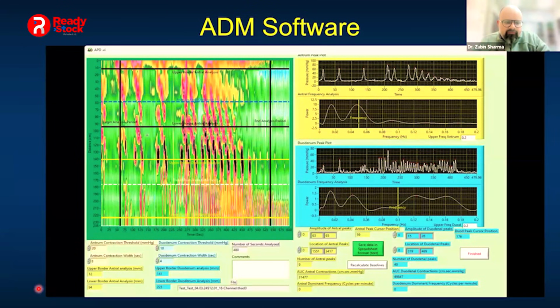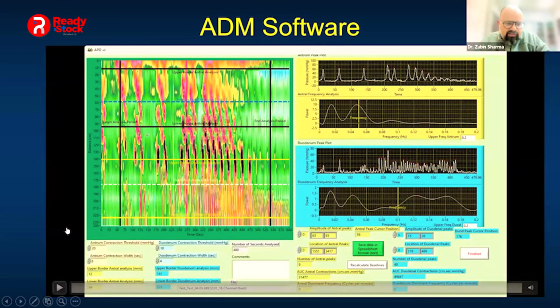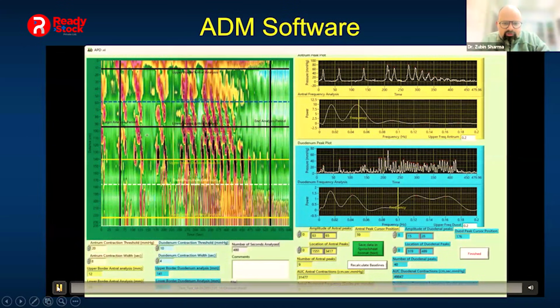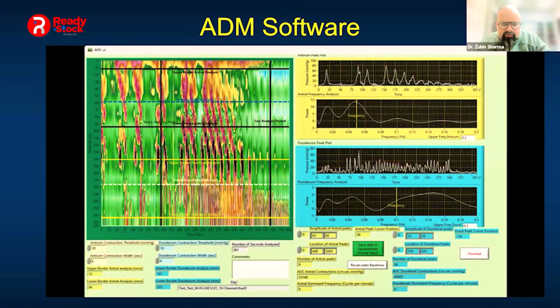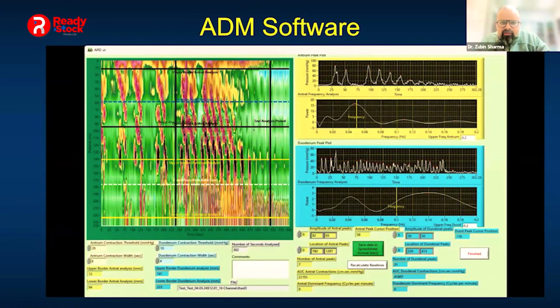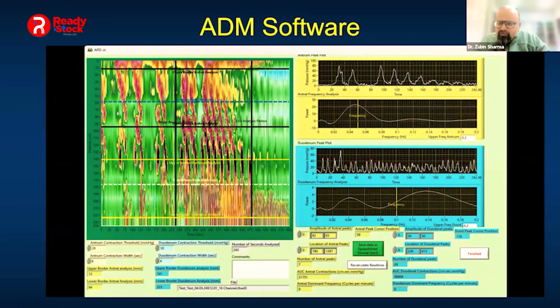And we also have the added software. Dr. Hubbard was kind enough to make it for us. You can use this. I think it will be given to you along with the catheters. Here it's not like the esophagus catheter or software. There is no Chicago here. There is no London here. So it's just giving you the frequencies.